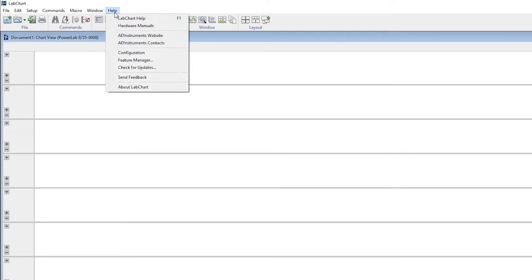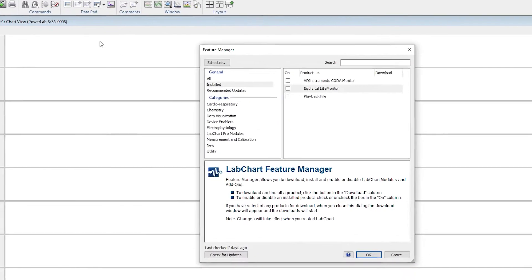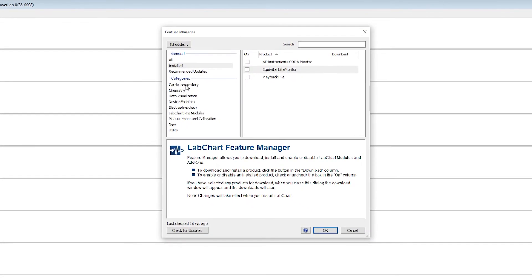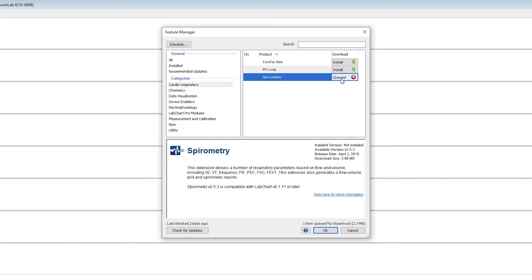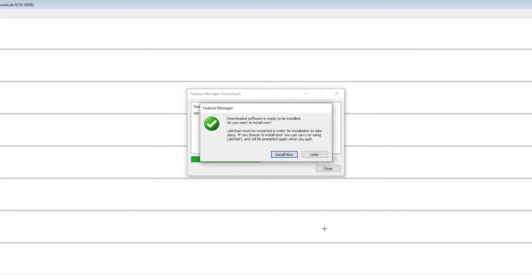For easy calibration of flow in liters per second, as well as setting up a volume channel, the spirometry extension can be downloaded in the feature manager or from the AD Instruments website.